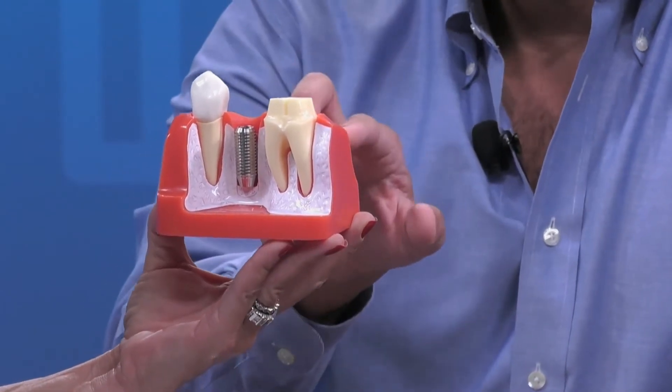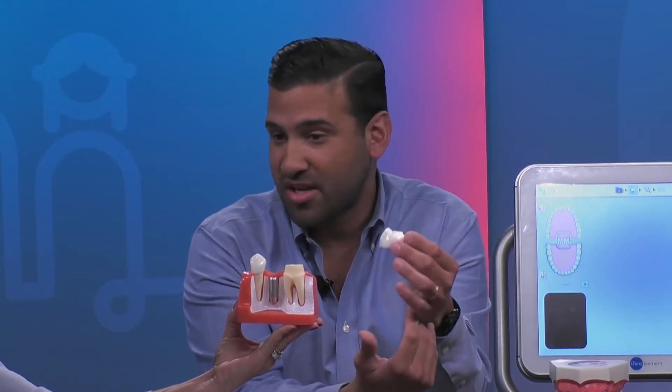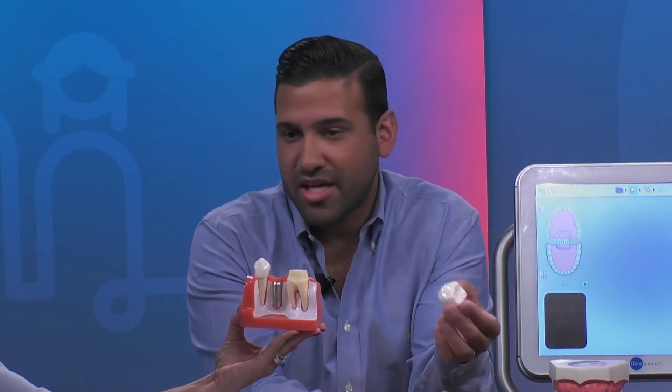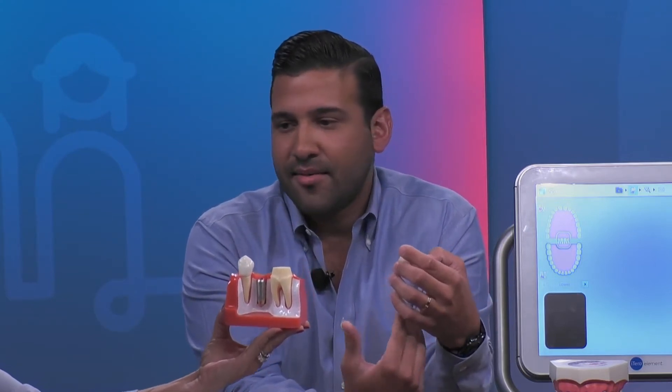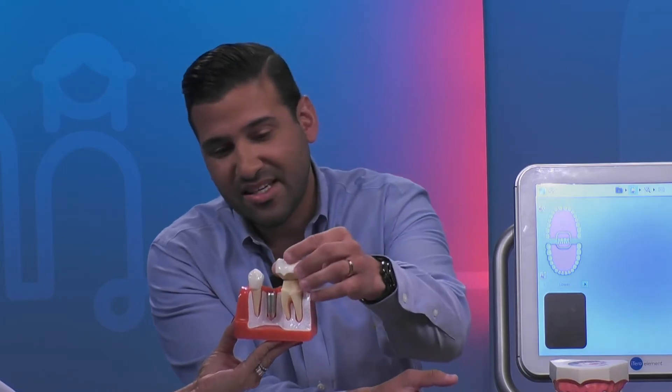Then we take a mold of this and we send it to the lab, and the lab will actually fabricate this crown — all in porcelain. There are different types of crowns; nowadays we use porcelain, some zirconia, which is a lot more aesthetic. And basically what we do is we take this and we cement it onto the tooth, and that is exactly what a crown is.